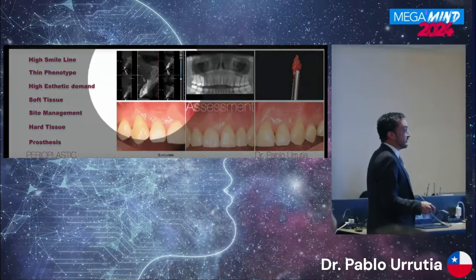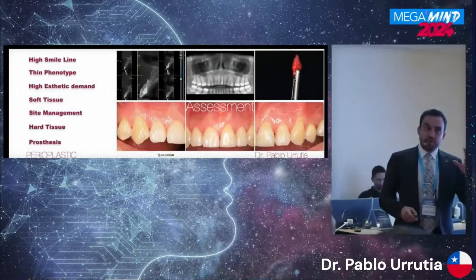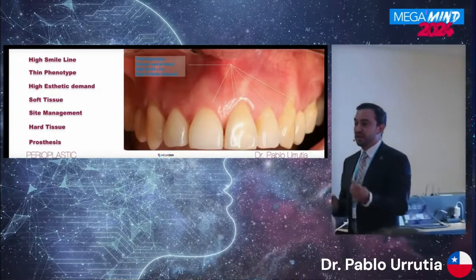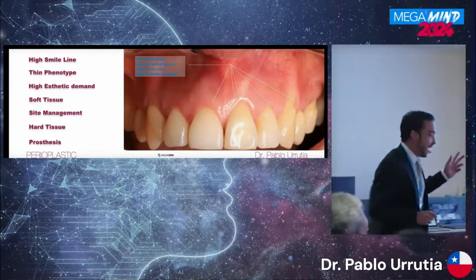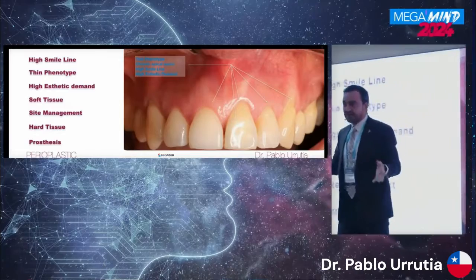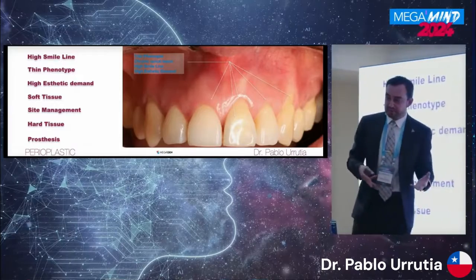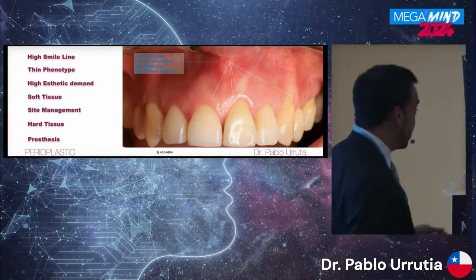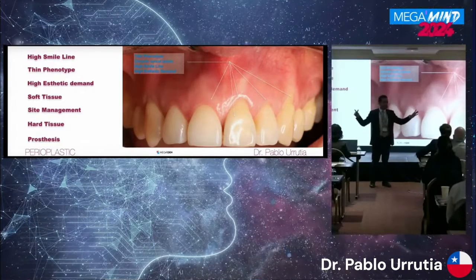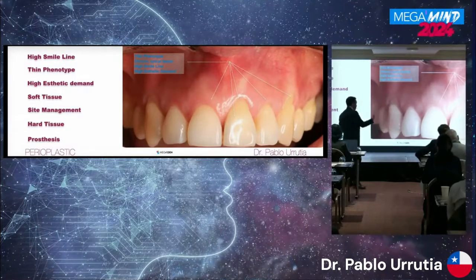We don't have a bone wall here, and there is granulation tissue, as this is a chronic lesion. So for us, we were thinking about how we can take this situation to another level. A very usual approach, ITI, I think, would be a safety flap, elevate everything, put some graft material, wait 6 months and then place the implant, or immediate implant placement with GBR, or early implant placement with GBR, but soft tissue healing maybe could take 2 years in that kind of staged approach. Soft tissue healing, GBR with implant placement, connection, and everything.